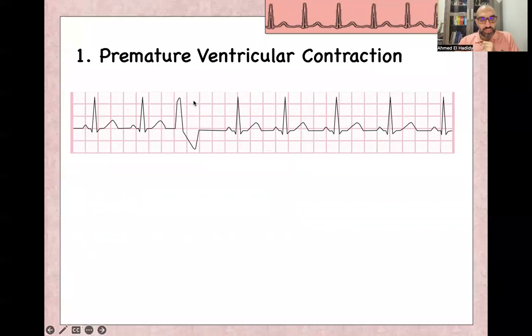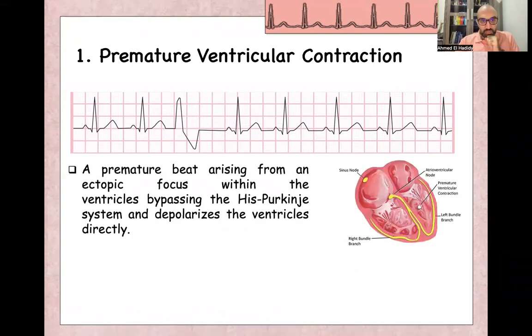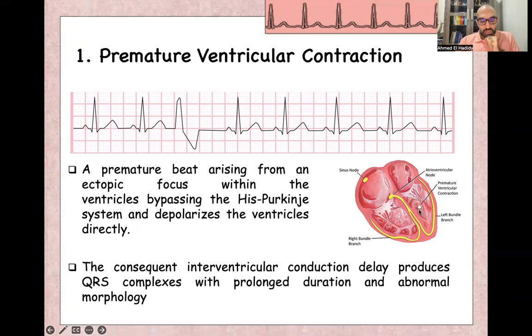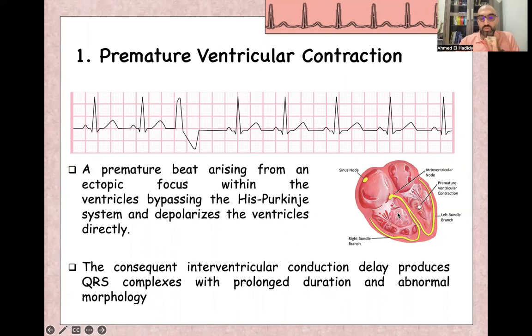Premature ventricular contraction is a single wide complex with discordance — QRS pointing up, T-wave pointing down. It is a premature beat arising from an ectopic focus within the ventricle itself, which bypasses the His bundle and depolarizes the ventricles directly. There will be interventricular conduction delay, producing a wide complex with prolonged QRS duration and abnormal morphology. The PVC focus first depolarizes one ventricle immediately, then depolarizes the other ventricle, leading to the wide complex.